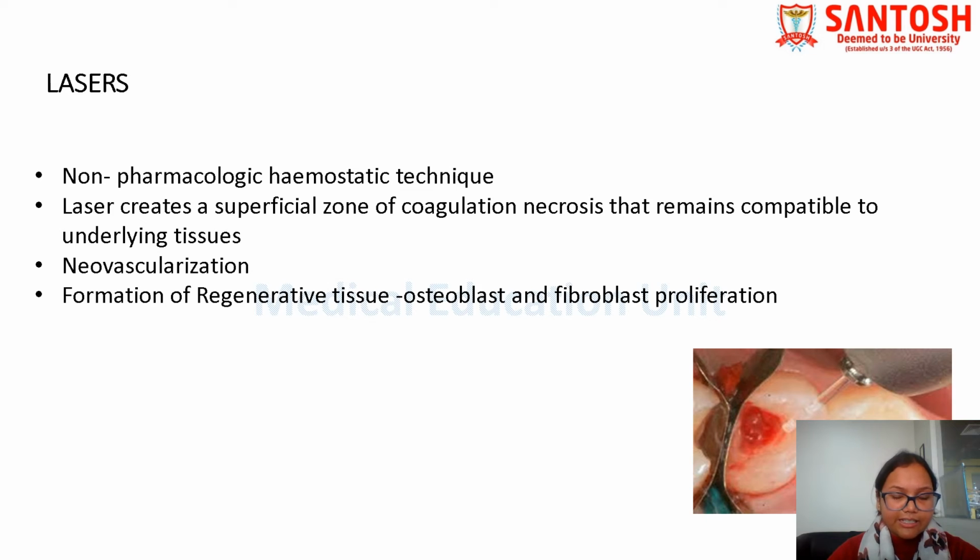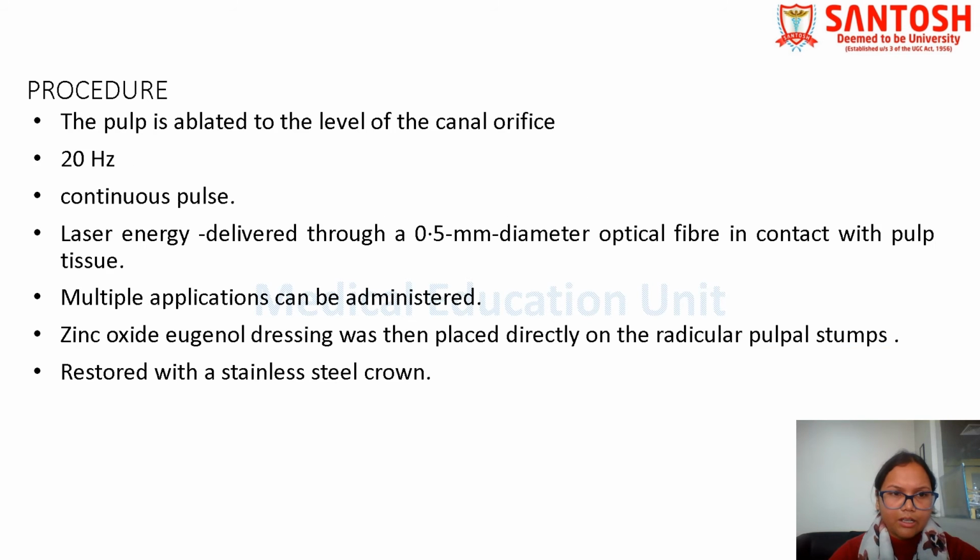Another process is laser, which is used for single visit devitalizing procedure. So it is a non-pharmacological hemostatic technique. Laser creates a superficial zone of coagulation necrosis that remains compatible to the underlying tissues. It also helps in neovascularization, and also forms regenerative tissue, that is osteoblast and fibroblast proliferation. So the procedure includes the pulp is ablated to the level of the canal orifice and the frequency used is 20 Hz in a continuous mode.